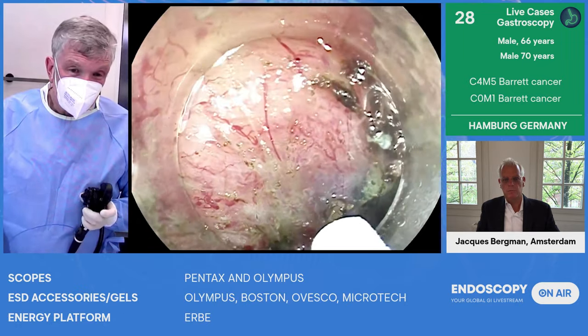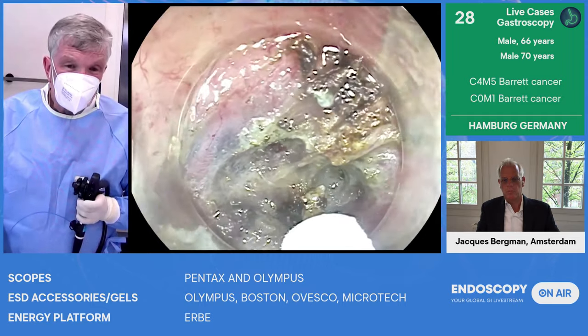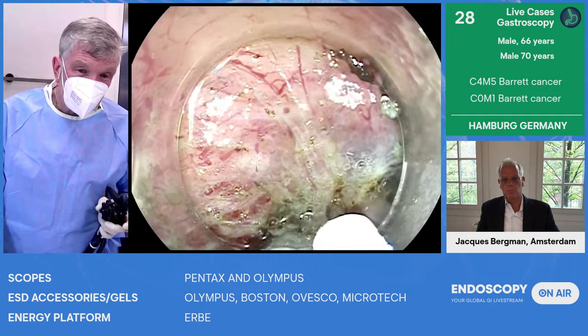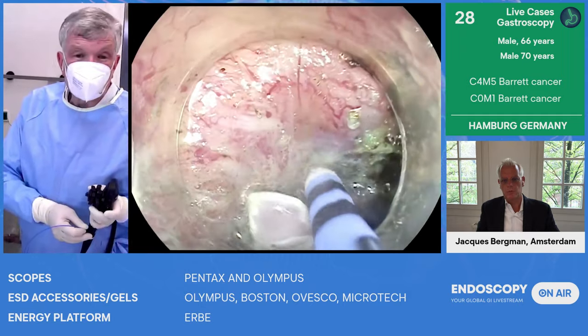And here's a vessel again. So this is what we are going to do. We're dissecting this around. This is also not deep enough. Now inject again.